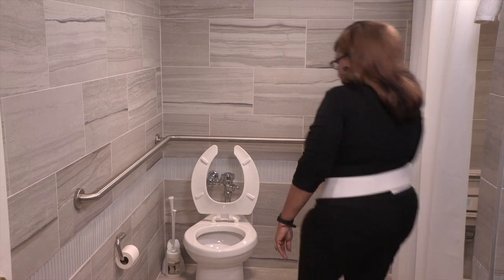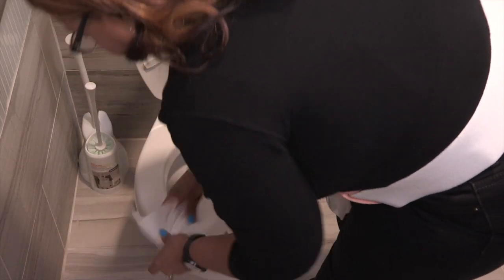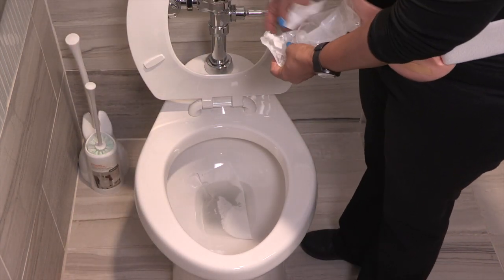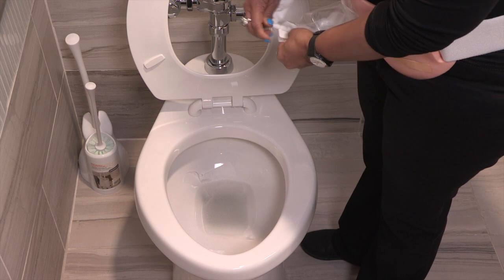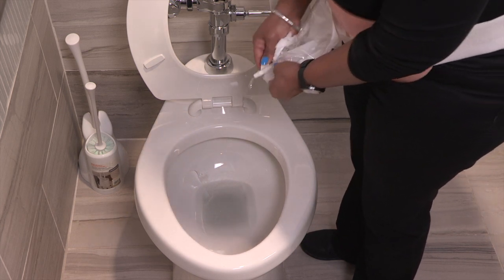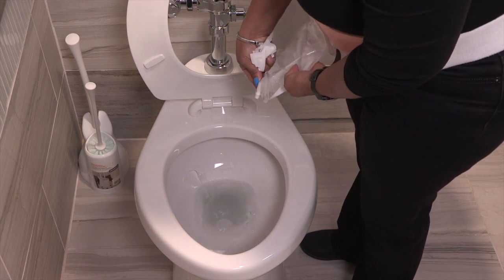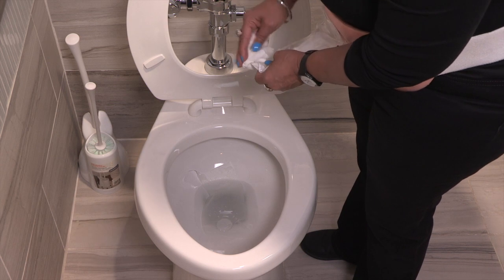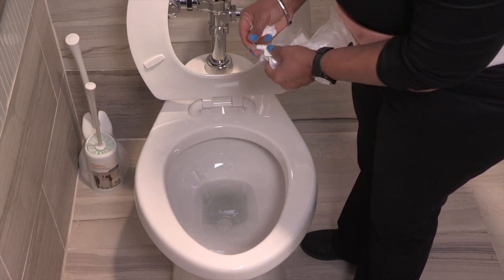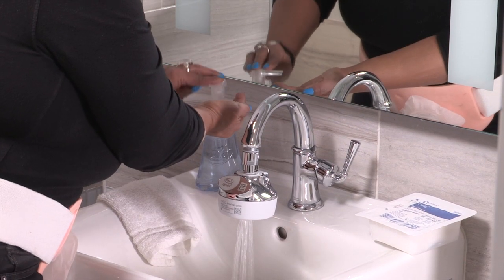First, open your pouch to let the urine run out. Make sure you do this over a toilet to catch the urine. You can put a piece of toilet paper in the toilet first to keep the urine from splashing. Once the pouch is empty, wipe it with toilet paper and close it so no more urine runs out. Then wash your hands.